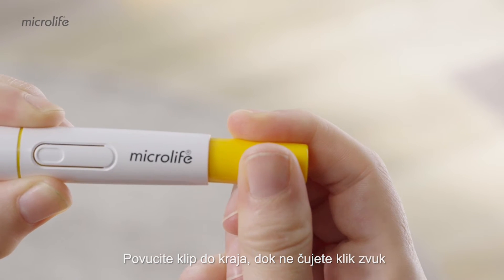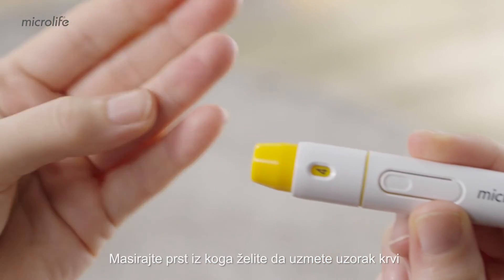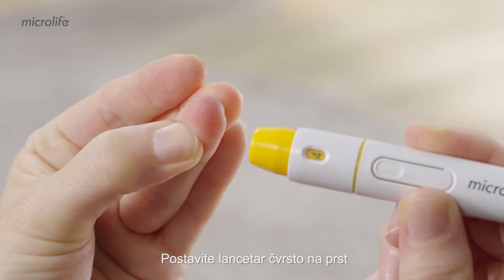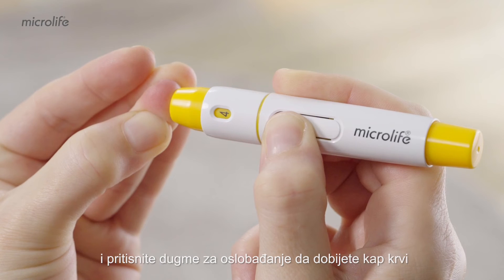Pull the plunger all the way down until a click sound is heard. Massage the finger you want to take the blood sample from. Hold the lancing device firmly against the finger and press the release button to get a drop of blood.